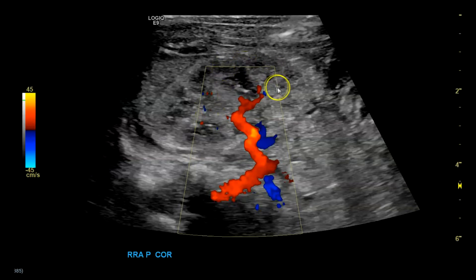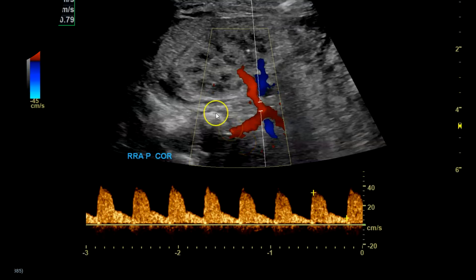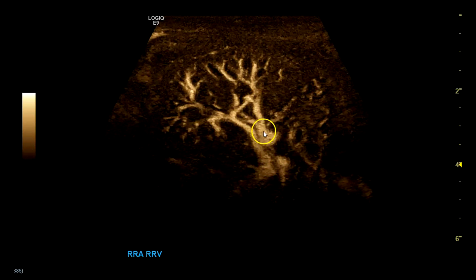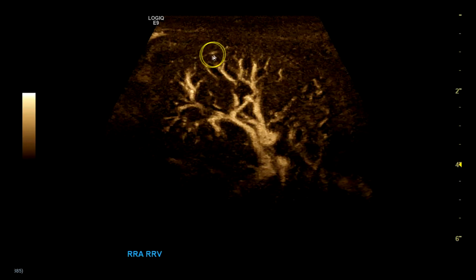Here's the aorta, right renal artery going into the hilum. With B-flow you see the artery, a piece of the aorta, and the right renal vein. You can see B-flow showing the segmental renal arteries, the interlobar renal arteries, the arcuate arteries around here, and then here's the edge of the kidney which would have the interlobular arteries.